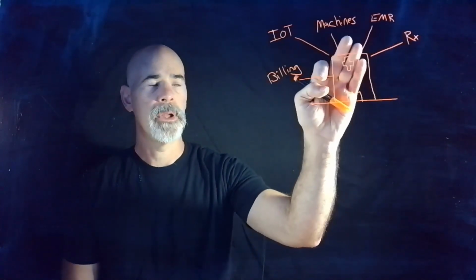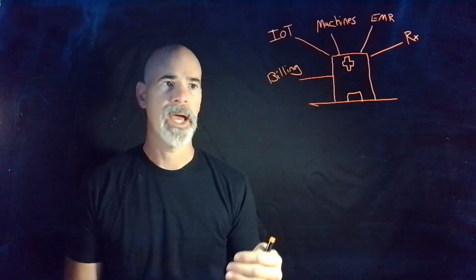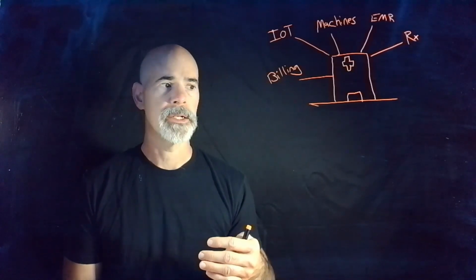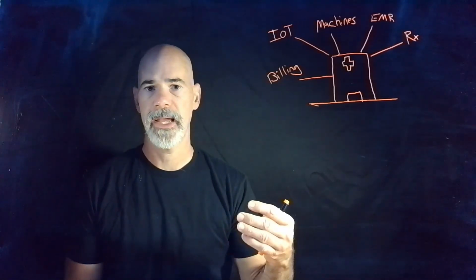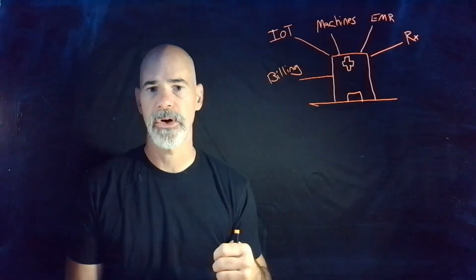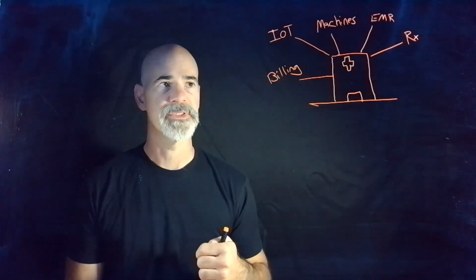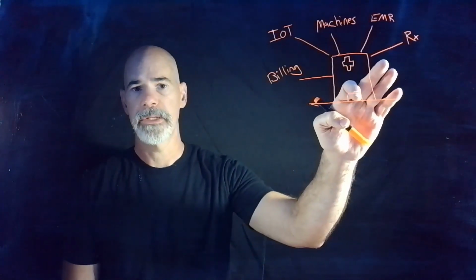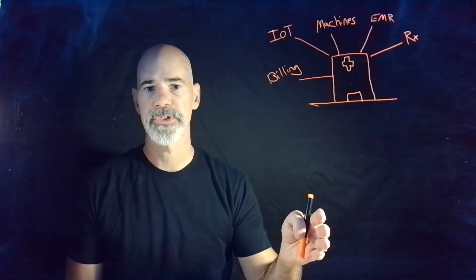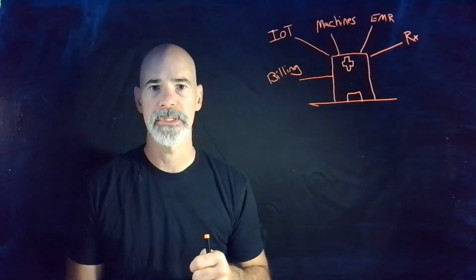You have machines such as CAT scans, MRI machines, X-ray machines. You have your different carts that are all throughout the hospital where physicians and nurses can use those to help provide care to patients. A lot of those are connected. You have all the machines that are in the different hospital rooms that are generally connected to the overall hospital system. You have tie-ins to pharmacies, whether it's the on-premise pharmacy in the hospital to send prescriptions to, or maybe outside pharmacies where you might have to send prescription scripts.